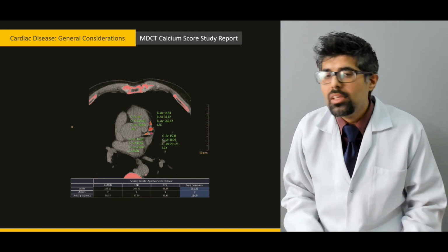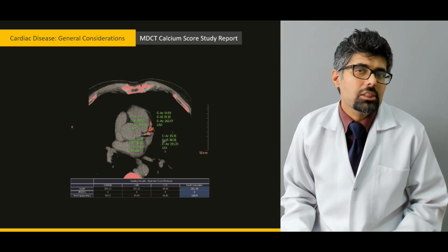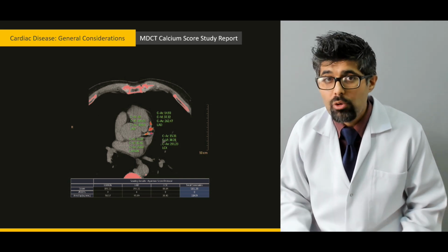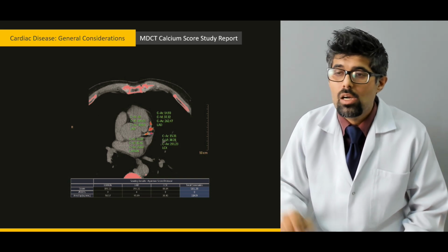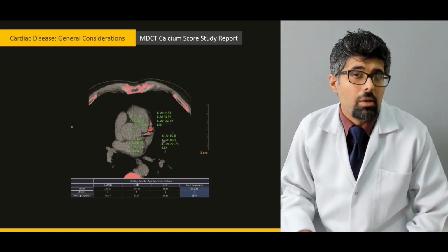Now, one thing should be pointed out here: risk assessment, like calcium scoring, is no alternative to regular modalities like the perfusion scan, the echocardiography, the thallium scan, the cardiac CT or the MRI.